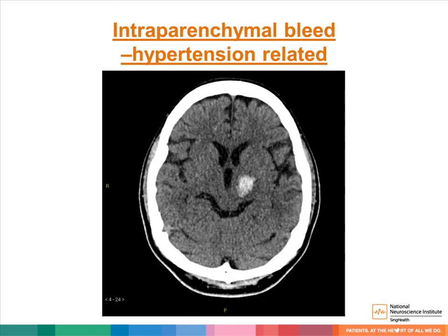Not all patients presenting with clinical symptoms of stroke have an underlying ischemic stroke. Some patients have hemorrhagic strokes. In this patient with uncontrolled hypertension, there is a left thalamic hemorrhage. Do note that hypertensive-related hemorrhages in the brain can occur in the basal ganglia, thalamus, pons, and cerebellum.